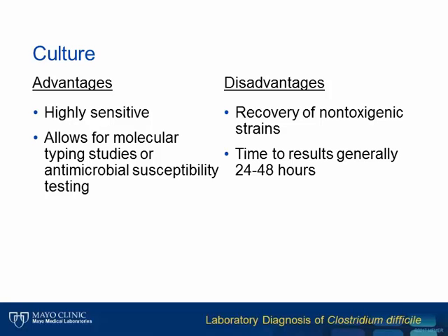Culture is a highly sensitive method of recovering the organism when selective culture media is used. Recovery of strains allows for further molecular typing studies, such as for comparison of relatedness of strains, or for antimicrobial susceptibility testing when indicated. However, non-toxigenic strains can be recovered in culture, so further testing is required to confirm toxigenicity. Time to results is typically 24 to 48 hours.